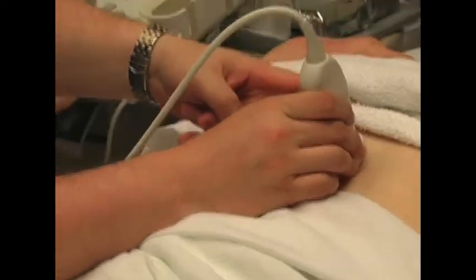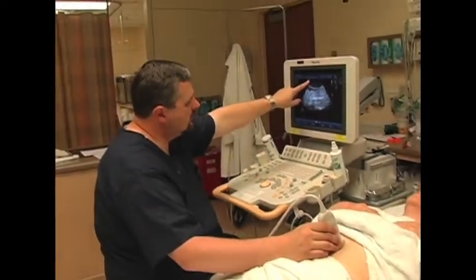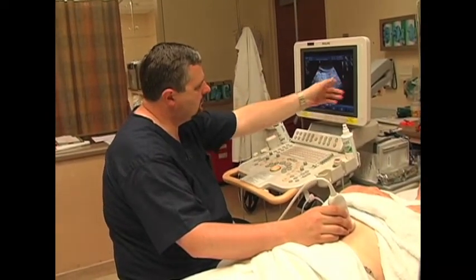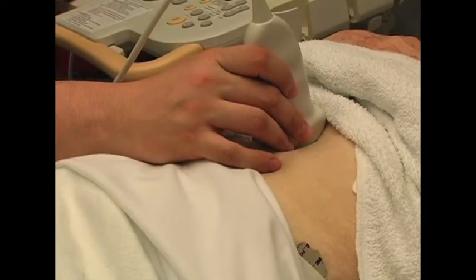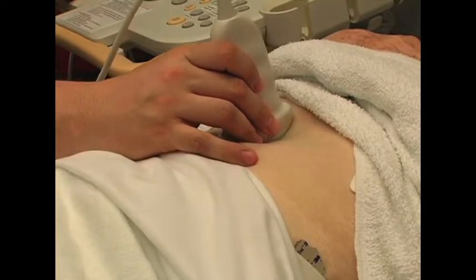The transducer indicator corresponds to the indicator marker on the ultrasound screen. So in the sagittal plane, the patient's head is to the left of the screen and the feet are to the right. We start with the transducer in the midline, just under the rib cage, and then sweep slowly towards the patient's right.